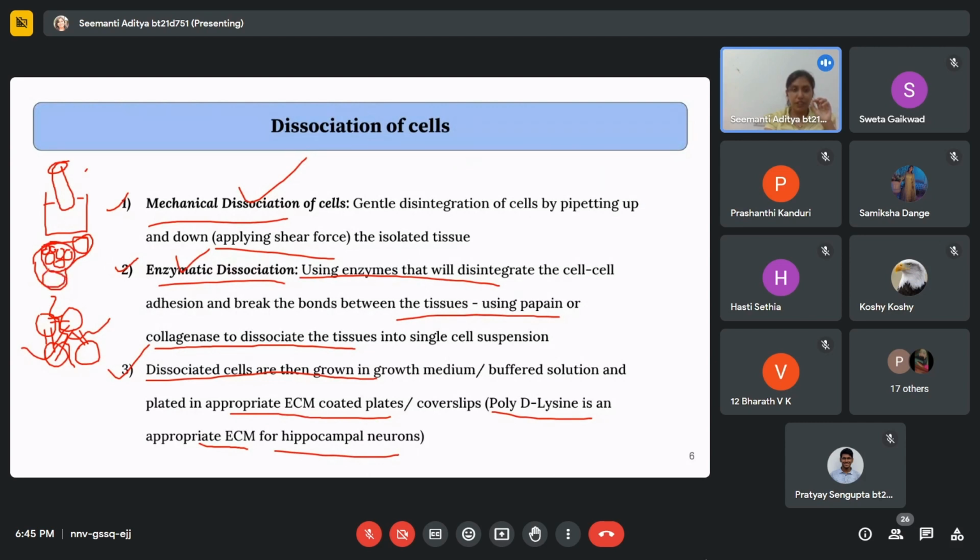If you want to specifically isolate a particular tissue, then we need to cut out the liver from those regions. This region's tissue is composed of several cells. These cells are clumped together because they are functioning as a tissue together, in a group and in a colony.